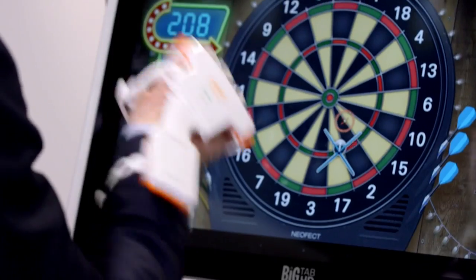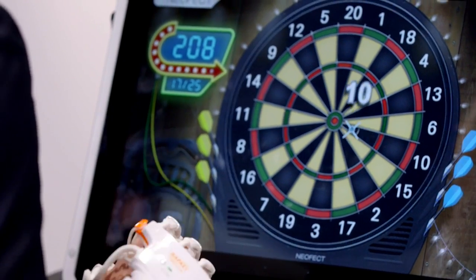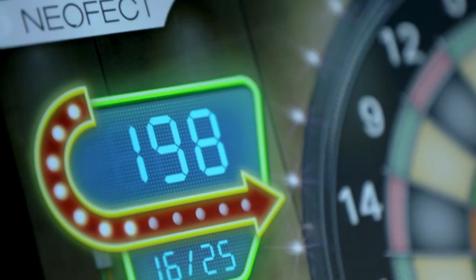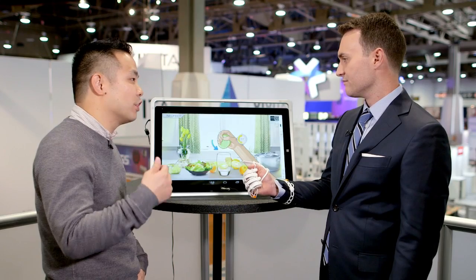So this device isn't changing my motions, it's just reading the motions. It doesn't move your hand, but it's reading your motion — and that's actually the key point, because this product is all about neuroplasticity. When it comes to stroke patient rehabilitation, what matters most is doing the repetitive motion so that you can start stimulating your brain.